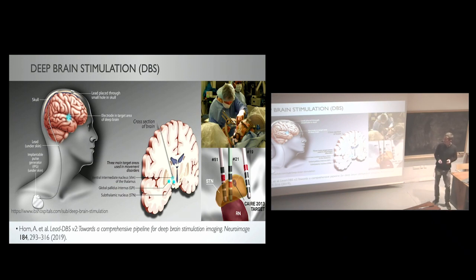So the main application here is to look at deep brain stimulation surgeries. Deep brain stimulation, very along the line of the talk this morning, but not with optogenetics, but more brute force, an actual electrode that is implanted deep into the brain, is a very efficient therapy for motion disorders, mostly due to Parkinson's, where you can really suppress the tremor that comes with this disease.